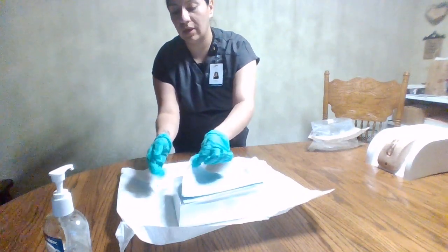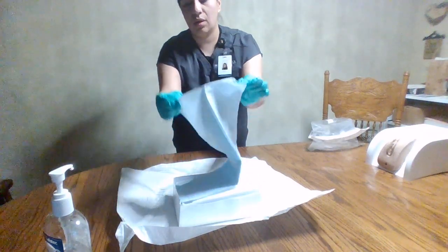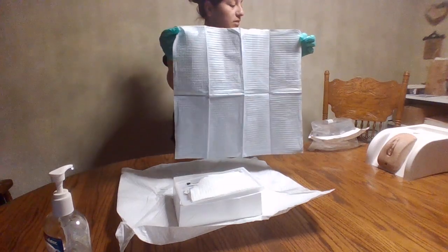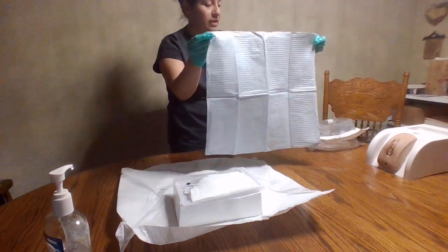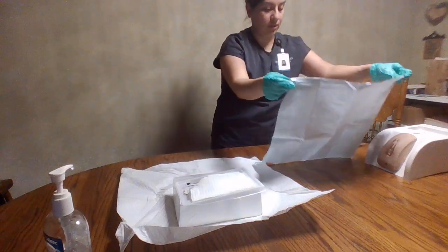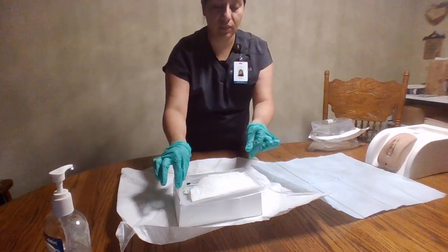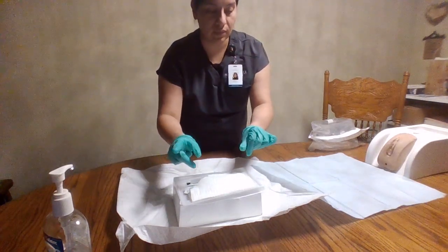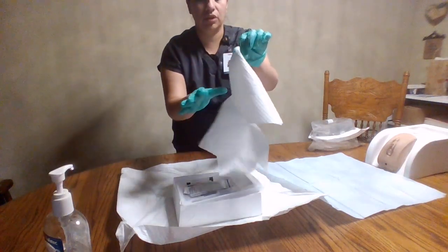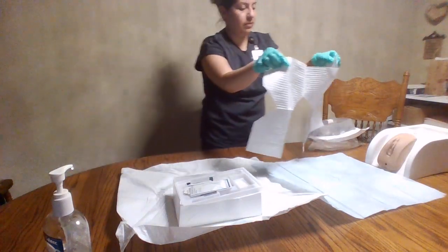Next, I will begin by opening up the sterile sheet. All right, Mrs. Smith, if you would please go ahead and lift up your hips. I can go ahead and place this drape underneath your bottom. Okay. All right, and then I do have the perineal sheet as well. I'm going to go ahead and drape that over you as well.